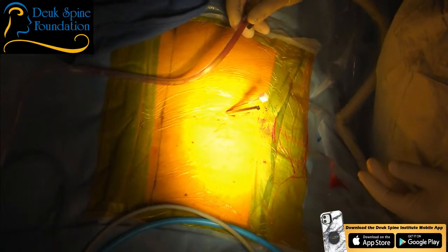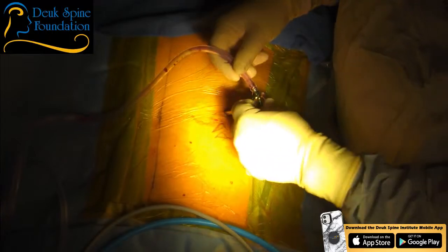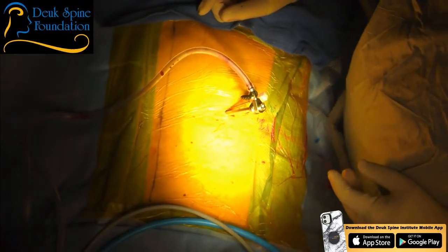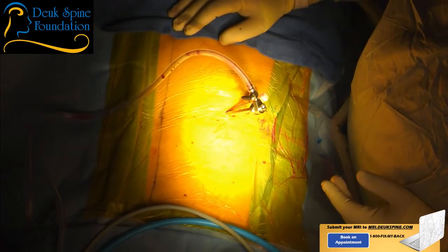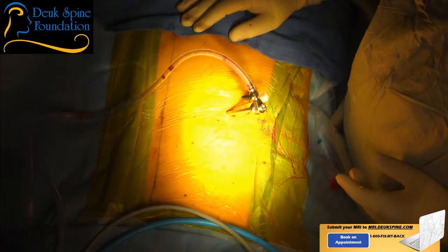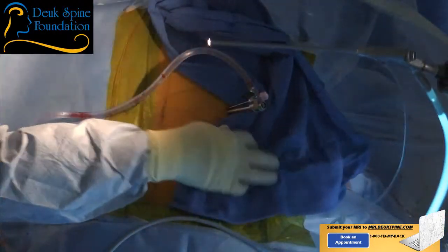Come on, Jordan, I'm hitting this thing, get it out of there, pull it back. Is there any reason you're just leaving it right here? Pull it back. Please don't try to change the way I do things without a very good reason. Pull it back further. Okay, look, Jordan, what's the purpose of pulling the fluoro out? So I have room, right? And who else needs room? Thank you. So why would you put it so close to his unsterile head so that he can rub against it? There you go. Now that's smart. You see? And that's the way it's supposed to be every single time. You know, in surgery, we figure out things, and we don't like to have to refigure them out again because somebody decides not to follow what we want them to do.